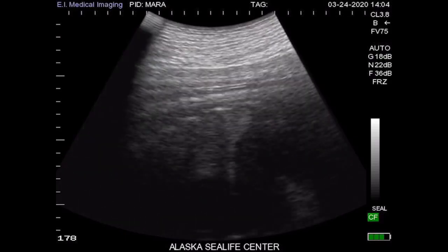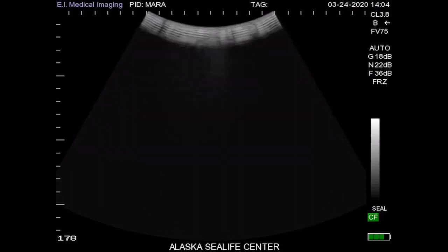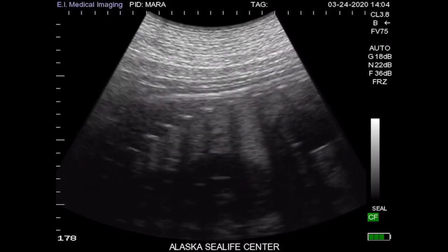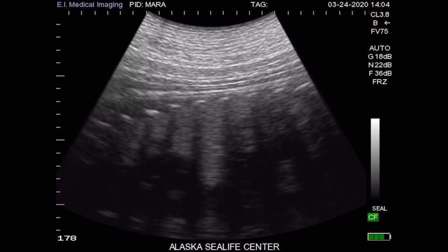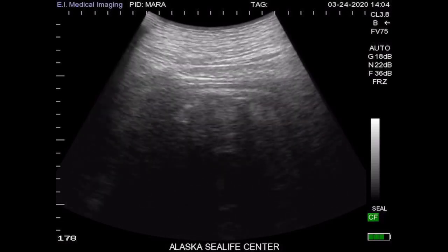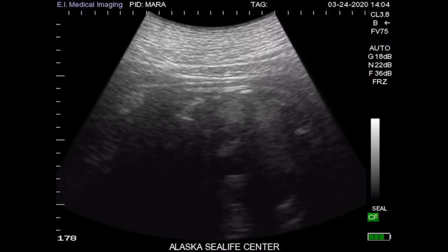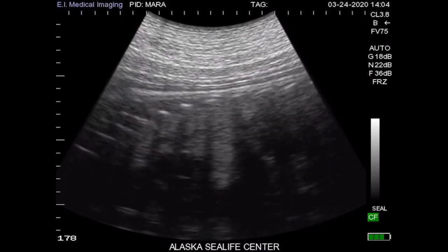Okay, so what we're looking at now is our ultrasound. If you look towards the top, you see some white lines. There we go. We have some spine and some rib cage right there. It looks like a little alien inside of her, but this totally shows us that we have a baby. And I think you'll be able to see some, there you go. You see some thumping in that rib cage? That's the heart.